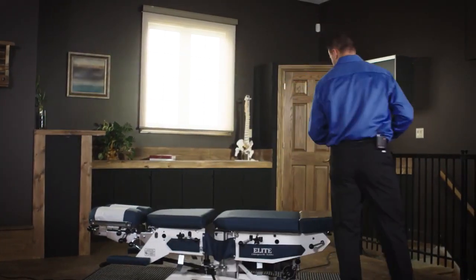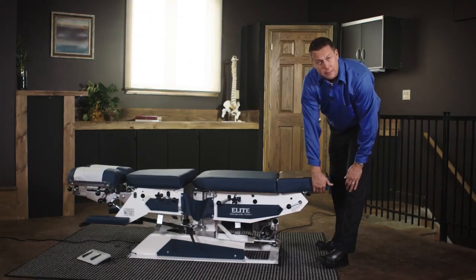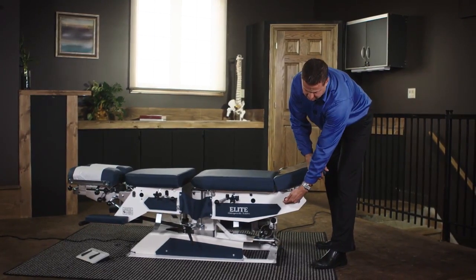In regards to some of the general functionality of the table, we have an extension piece to accommodate different patient heights. The knee break can be peaked up and lowered down by lifting it toward the ceiling.